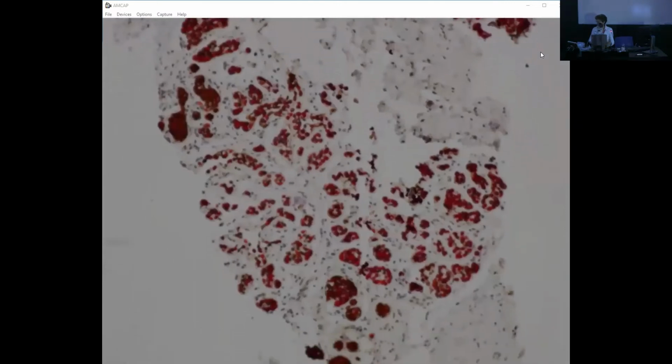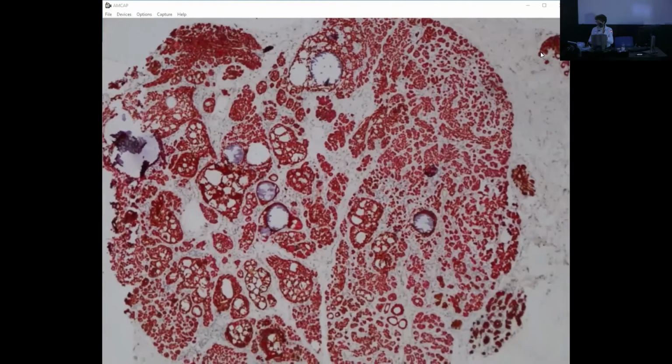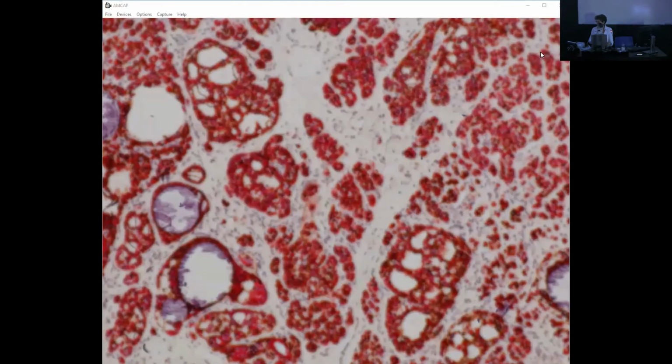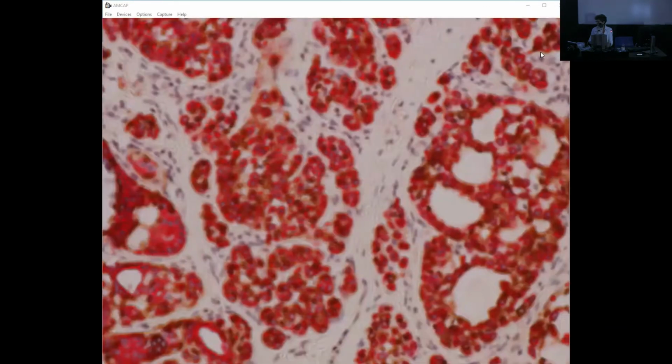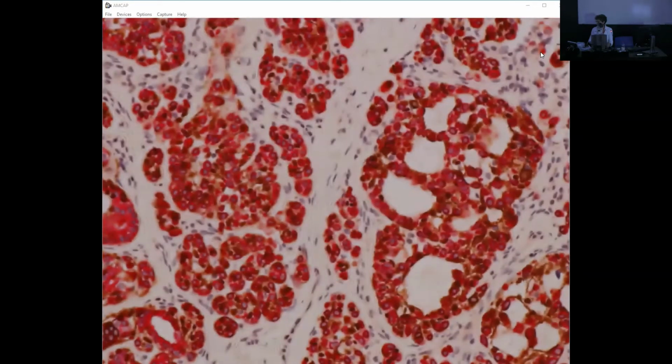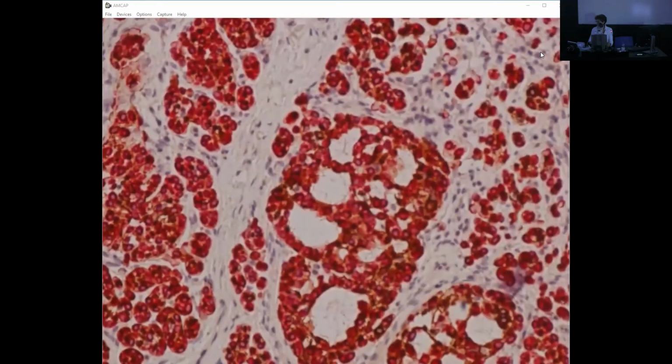It's good to see different morphologies, different cases. Here is the same case with the ADH5, I think, that antibody cocktail that I like very much. And it's right here. You can tell how many myoepithelial cells are present in this focus by the number of brown nuclei that are staining.